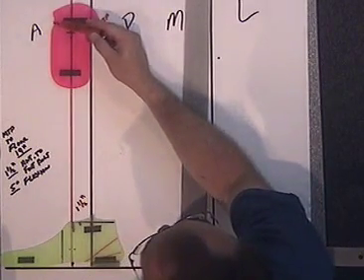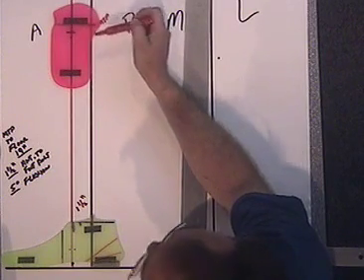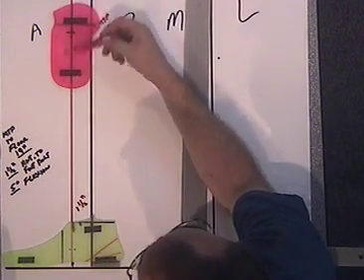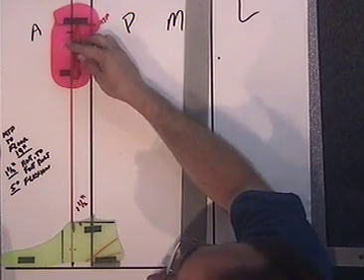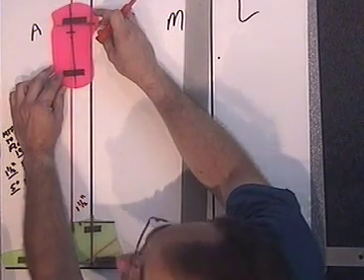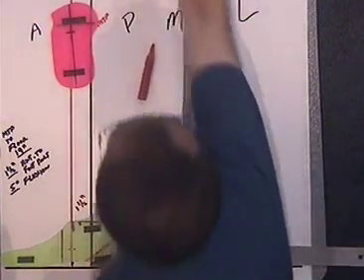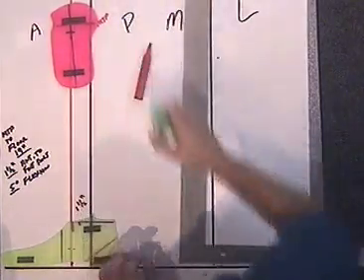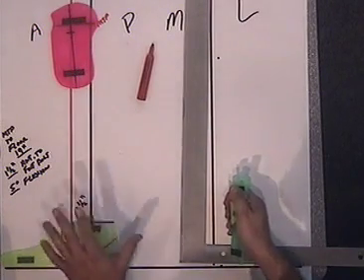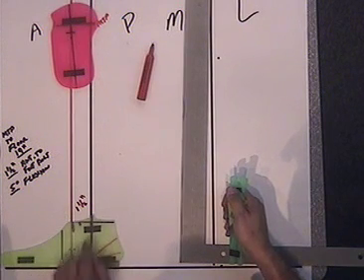Now, the MTP level corresponds with this little dip, and this dip's called the PTB bar usually, and this is the popliteal area back here. If you draw a line straight down through the socket and you place this vertical, that would be 0 degrees of flexion. Well, our standard value is 5 degrees of flexion, so we want to tilt this about 5 degrees. So you can see we're changing that, and we're giving it about 5 degrees of flexion into the socket. Okay. So after we have that done, we actually have the relation between the foot and the socket set. So we have 1.5 inches of anterior placement over the foot from the ankle bolt.